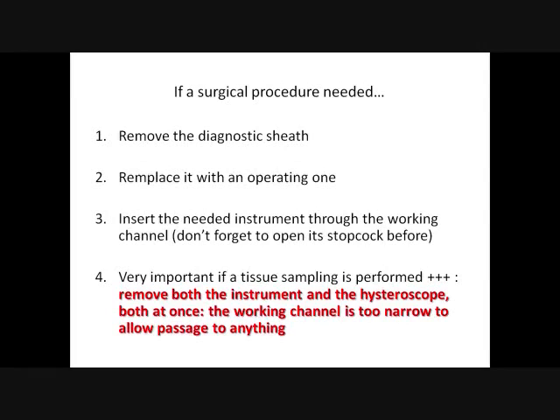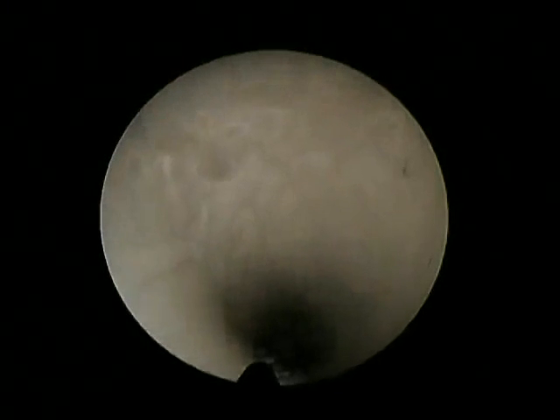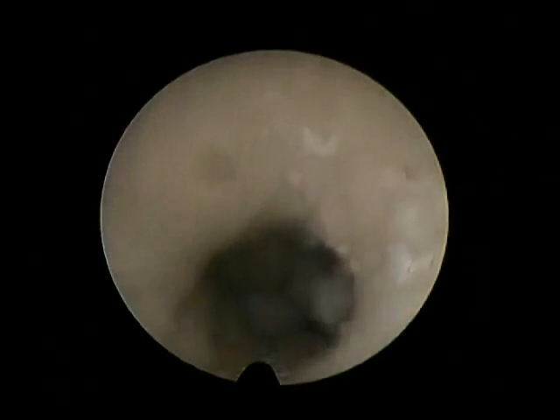It's very, very narrow. Now we're going to be able to see a few operating procedures, like removing a foreign body. So we get inside the uterus like already seen, at 6, slowly. We've talked about this many times. Let's suppose that something here in the middle is a foreign body. So we insert a forceps, the foreign body forceps. You're gonna see it. Here it is with its streaks. We take the foreign body and we remove both the instrument and the hysteroscope because that foreign body can't get through the working channel. We take it off and here it is.